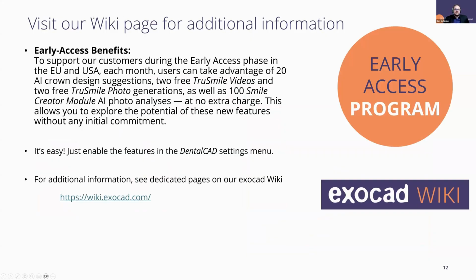With all of the AI services I was speaking of, we have AI crown design, True Smile video, and True Smile photo. Those are going to be available for the latest engine build, like I spoke of, but we have well-documented pages on our wiki page. So be sure to check those out. It's definitely some awesome services. You're going to love them, and it really enables productivity and increases communication and patient acceptance.